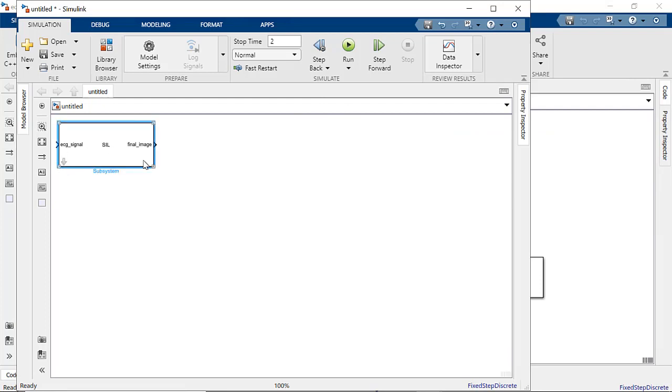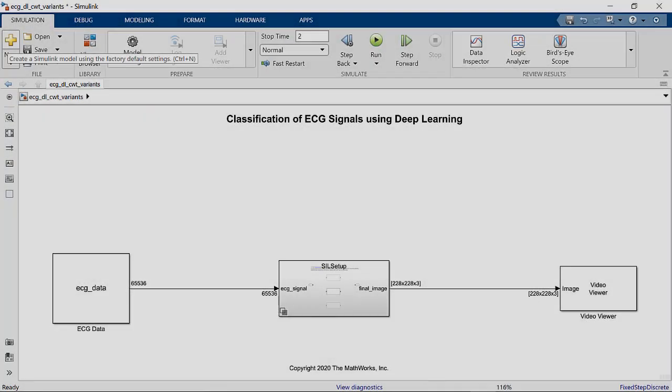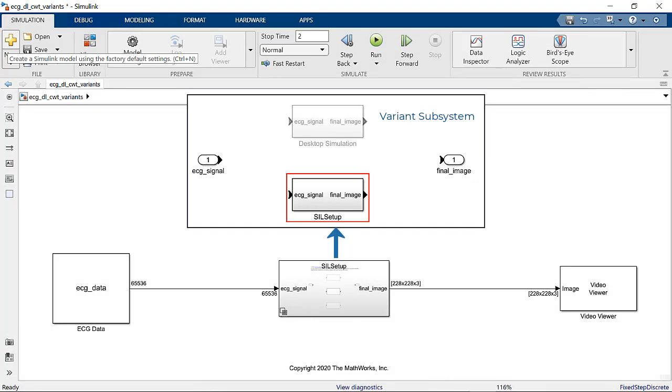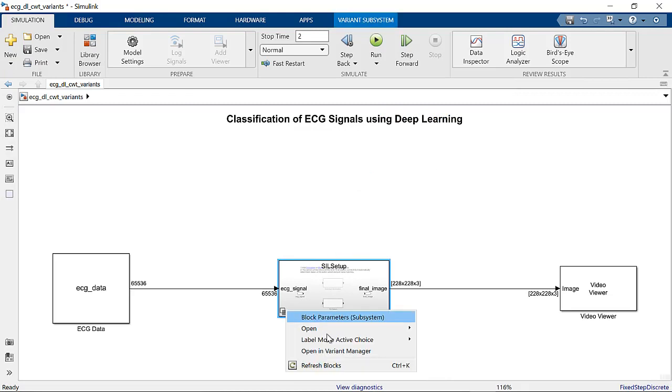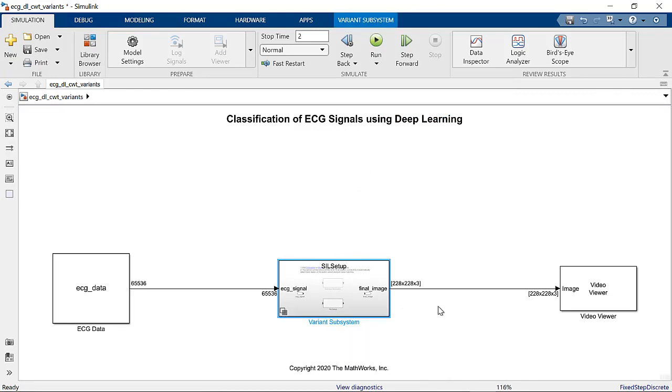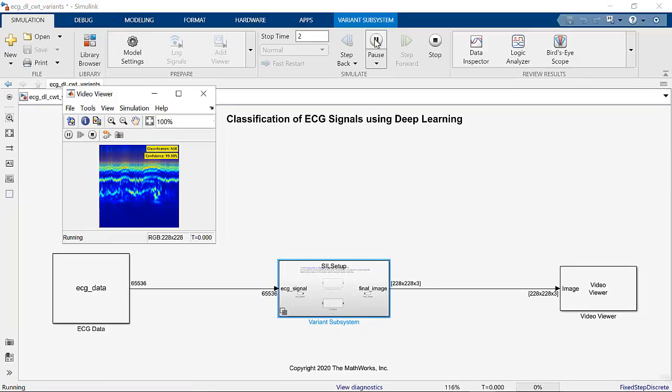Now, let's incorporate this SIL block with our previous Simulink model within a variant subsystem for ease of comparison with desktop simulation. On simulating the Simulink model with this SIL setup, we see that classification results match that of the desktop simulation.